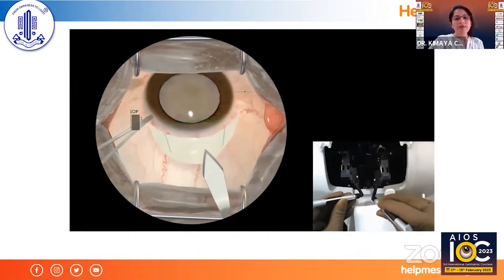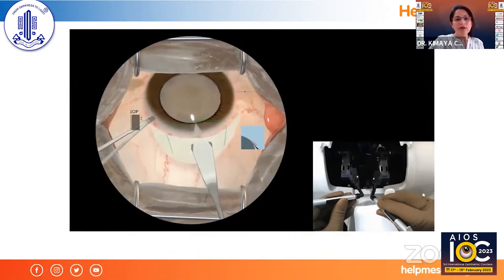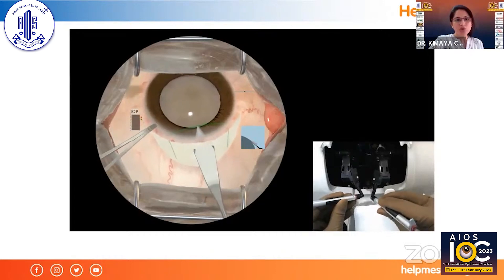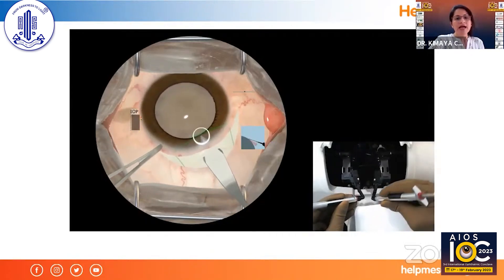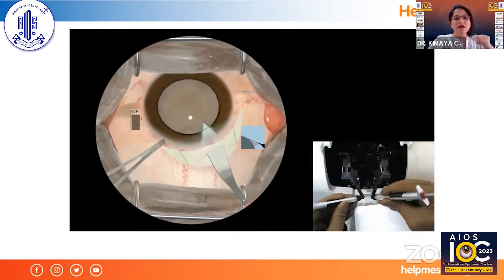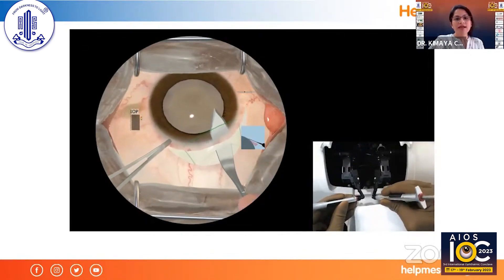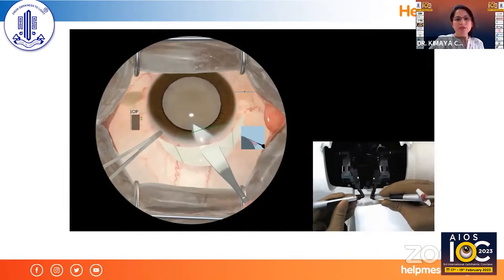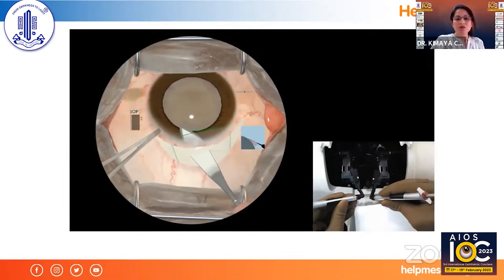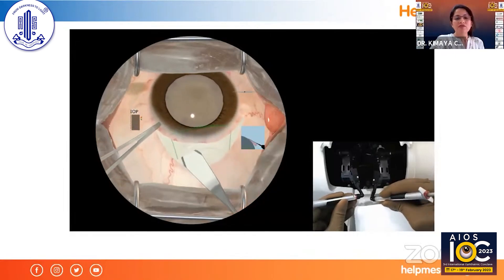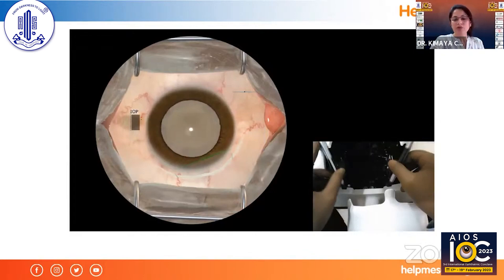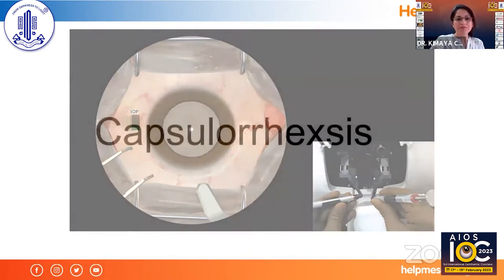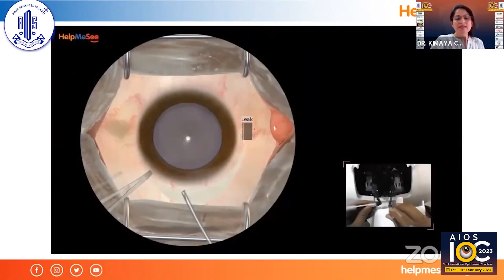Now I'm making the internal opening of the tunnel with the keratome as the instrument chosen from the desktop. You can see a lovely round ring, and I'm extending the inner incision — it's exactly the way you do it in live surgery, and you can feel the same thing here.